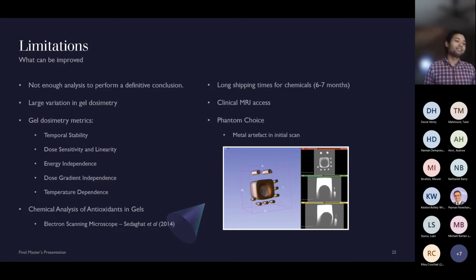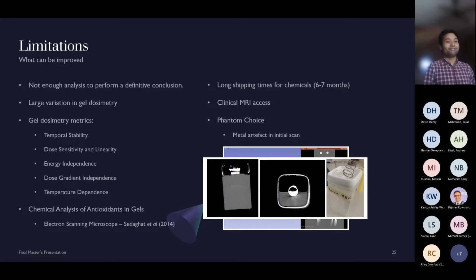And so, trying to find out what that is, I put it through CT and see that there's a spring there. With the other phantom measurements, we just took the spring out. But really, an MRI phantom should be designed for MRIs, not just for foodstuffs.